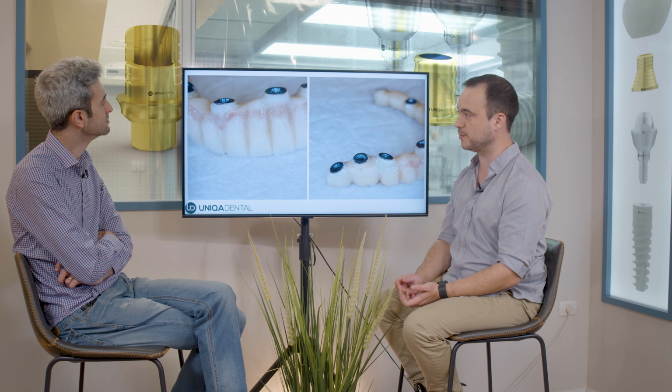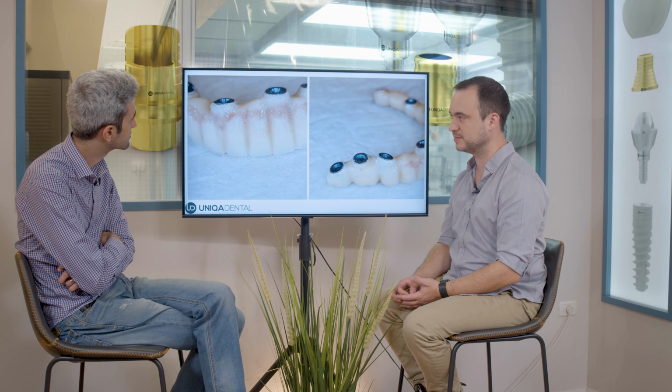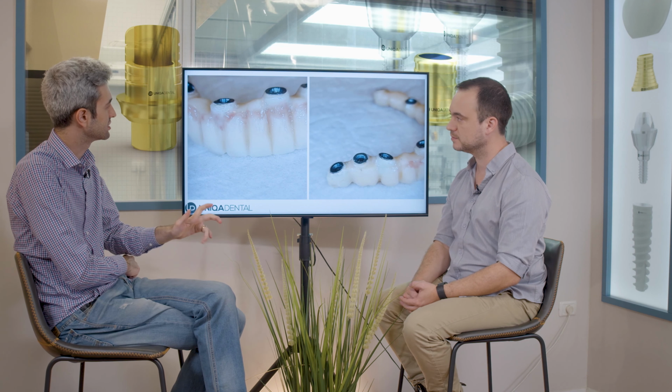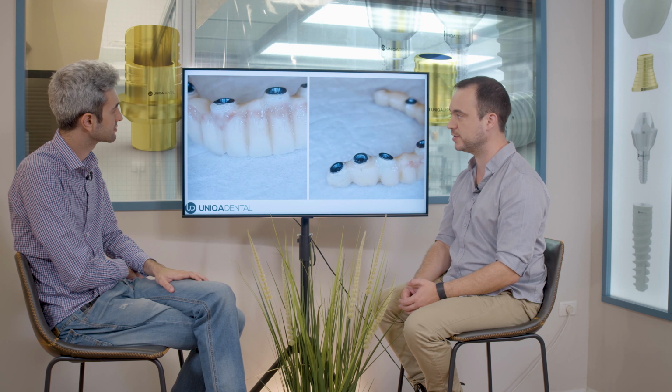You just close it with composite material for tooth fillings, the same thing, flowable. So it will go inside this slot. And then you polish it. Yeah, and then you just polish it. And you have a perfectly fine zirconia bridge, full monolithic zirconia.